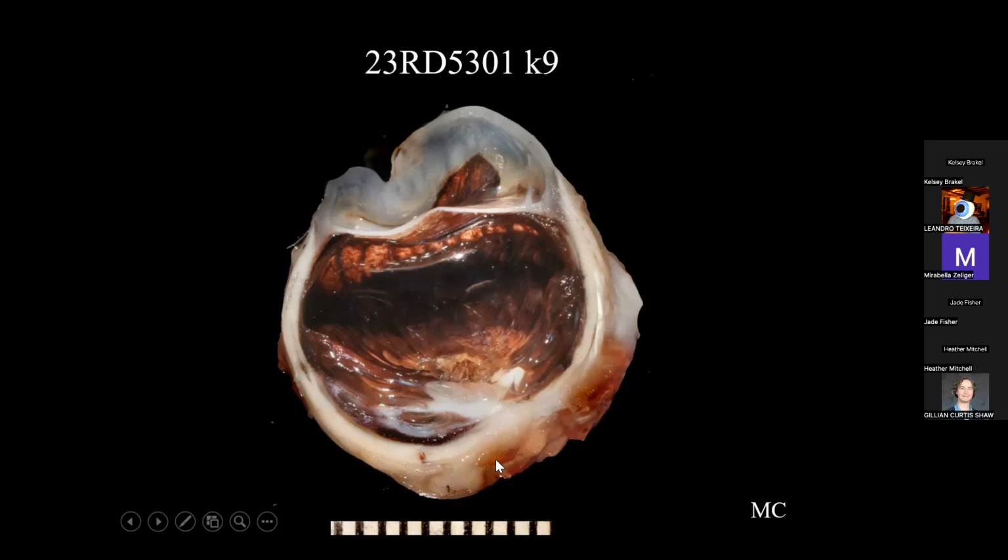The orbital tissue here was also likely very firmly adhered, which when we're grossing a globe, if we have a globe where there's this slight sort of divot in the sclera and the orbital tissue is very hard to move and tightly adhered to the back of the globe, that's a key red flag to go looking for a site of rupture. So we have a ruptured globe in this case that has become phthisical, and we don't know where the lens is at. So we'll take a look histologically for what we can see.